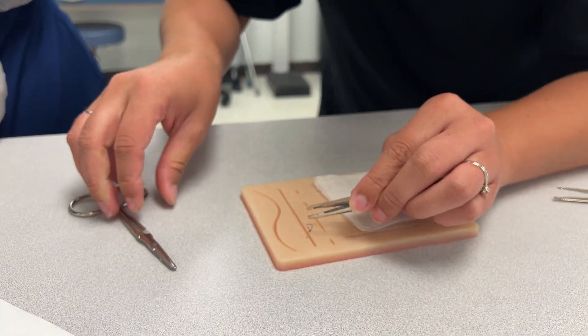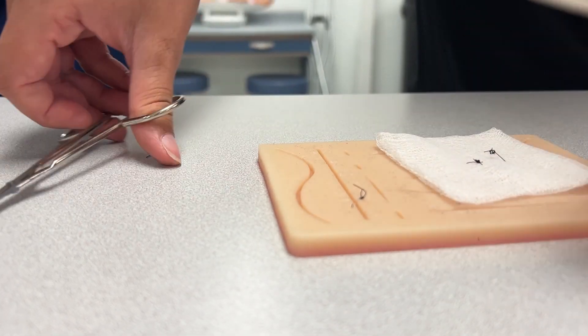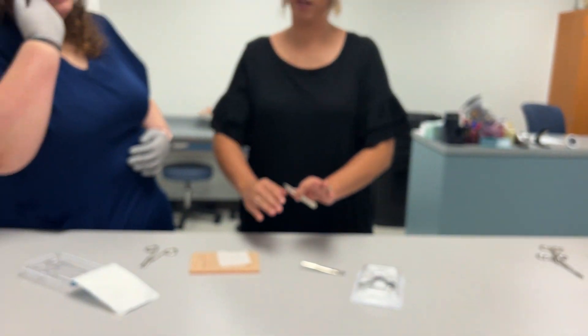This is not what we would normally do, but I can't get it out — I'm just going to have to untie it. That's okay, we'll pretend we got all three out.